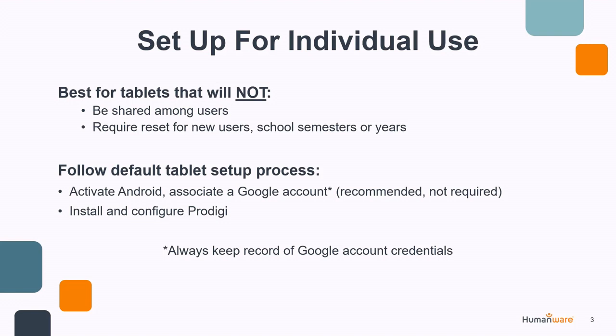If you don't have those credentials, which are required when you perform a factory reset of the tablet, this will in fact require that the tablet be returned to HumanWare for a factory reset process. It is not something that can be done in-house if you do not have those Google account credentials. So again, very important to keep those safe and secure, but definitely have them saved somewhere.